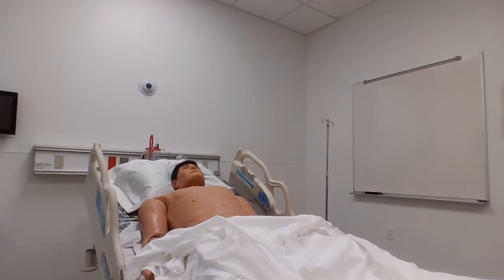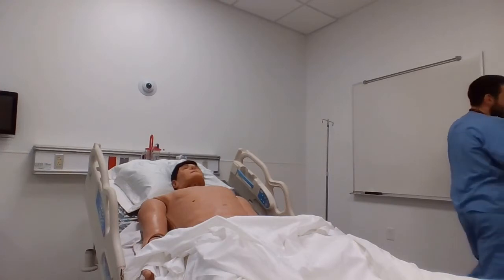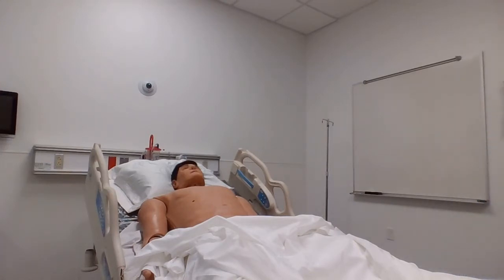Hello, Mr. Johnson. Hey, Blake from Respiratory. Is it okay if I come in and do a little assessment on you here? Okay, let me wash my hands here real quick. As I say, I'm from Respiratory, I'm going to come and do just a little assessment on you here real quick. How you doing today?